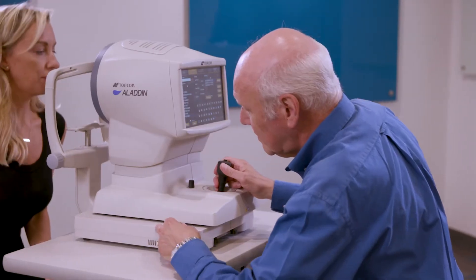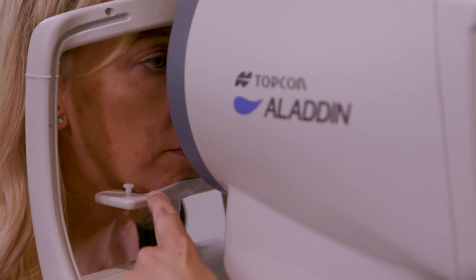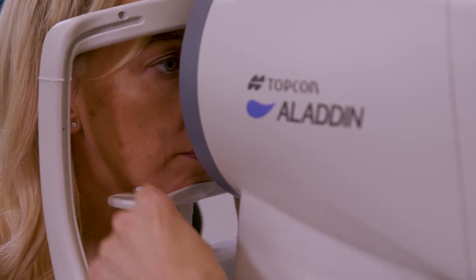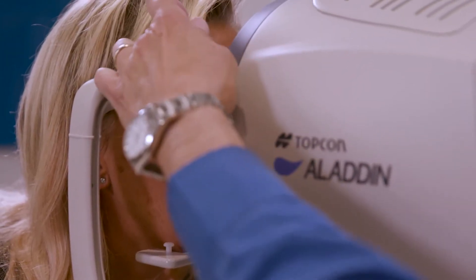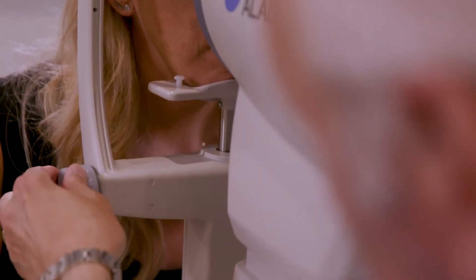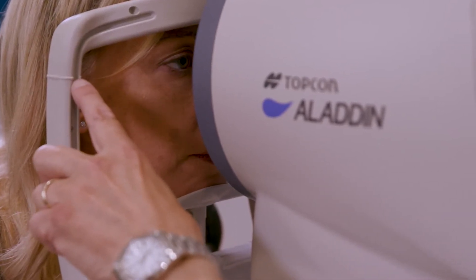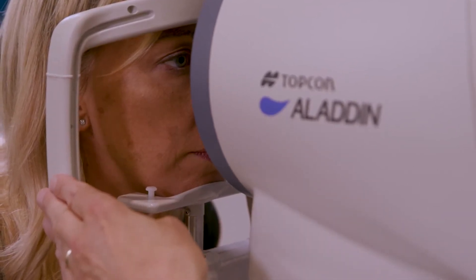First, we have to properly position the patient. The patient's chin needs to be firmly placed on the chin cup and the forehead always be in touch with the upper bar. This knob allows us to move the chin rest up and down until the canthus of the eye coincides with the marker on the side of the chin rest. Now we can start the capture.